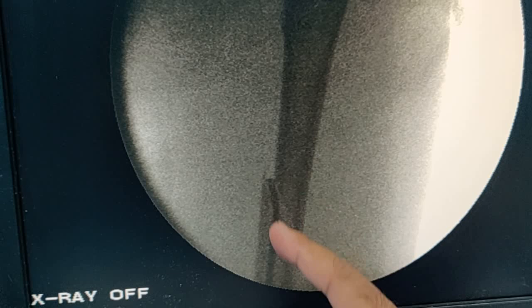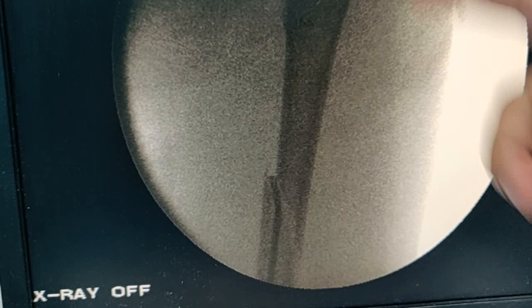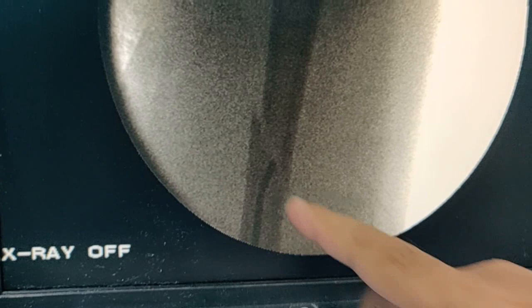After gentle tapping it has gone in the right direction. Notice there is a bend at the tip of the nail — that is done purposefully. The nail is now going in a certain direction, so all we do is withdraw it slightly, rotate it in the right direction, and gently hammer it so it enters the proximal fragment. We have withdrawn it slightly, the tip is now facing the correct cortex, and gently tapping will direct it the right way.